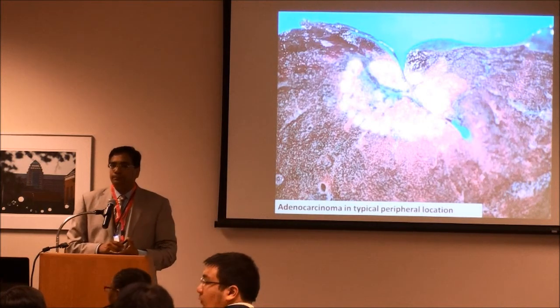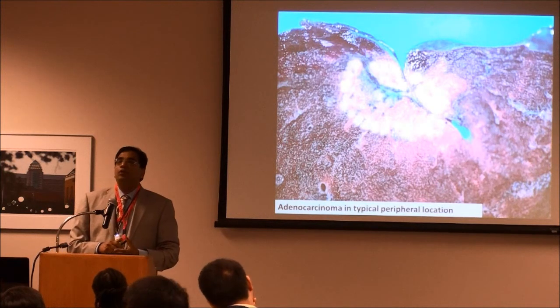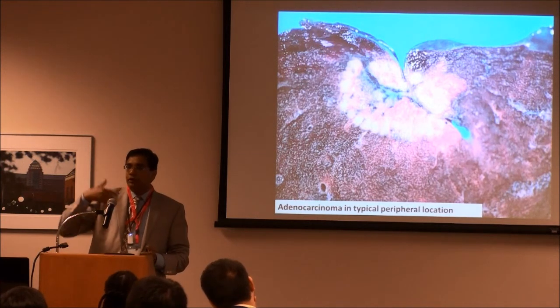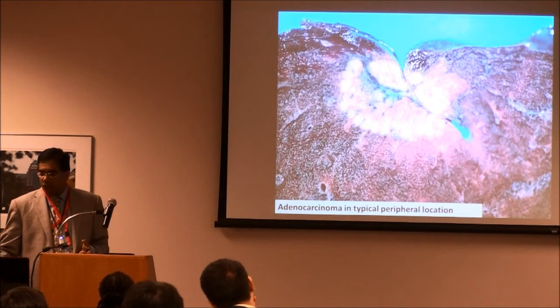Is there a reason why the tumor is white? Yes, there is a tremendous amount of fibrosis, a fibrotic stroma surrounding the tumor. That's why it's white. Fibrosis is always white. Scarring is always white.